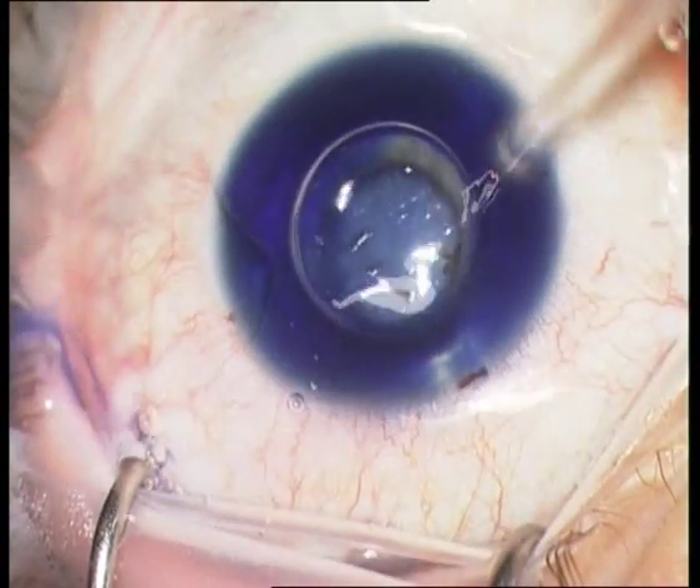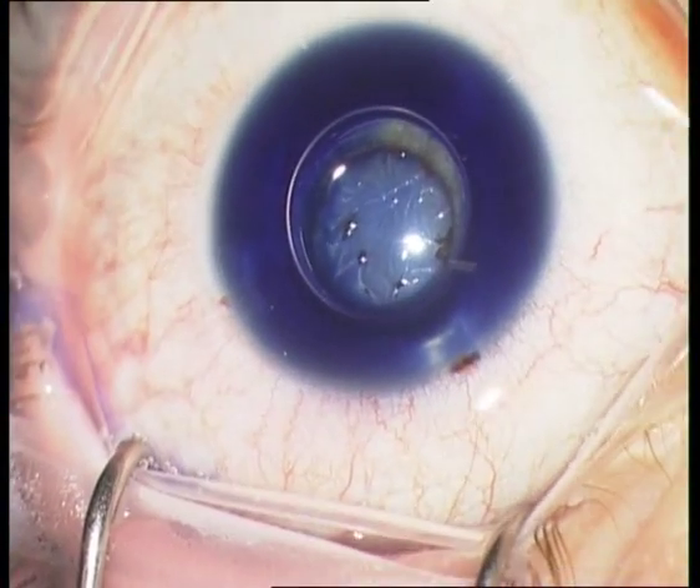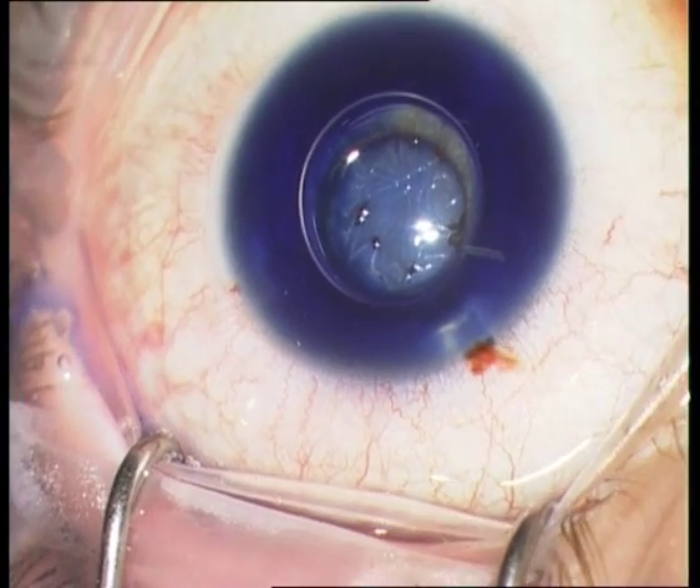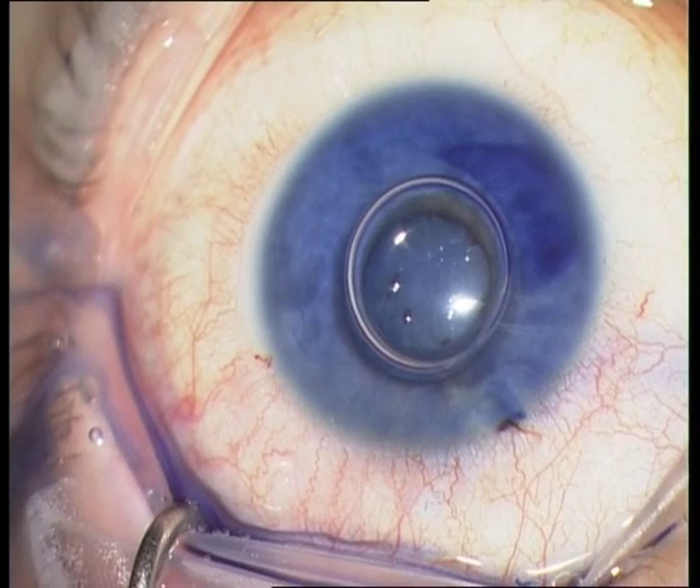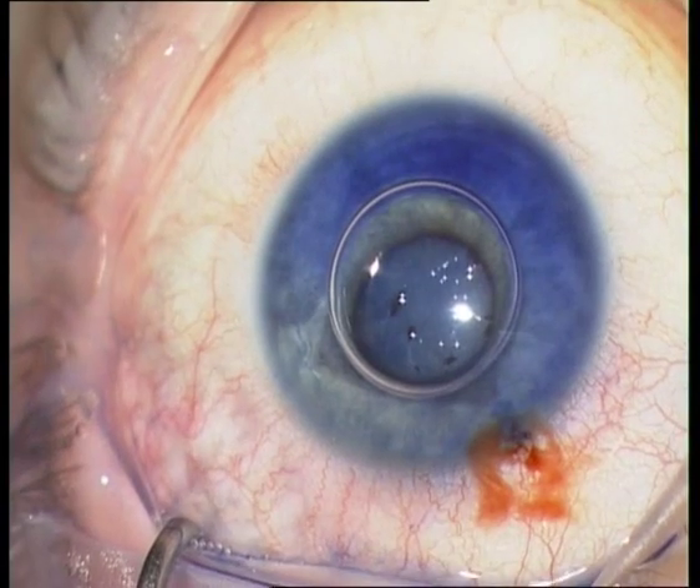I will present a cataract surgery of a 25-year-old female patient with a blunt globe trauma.